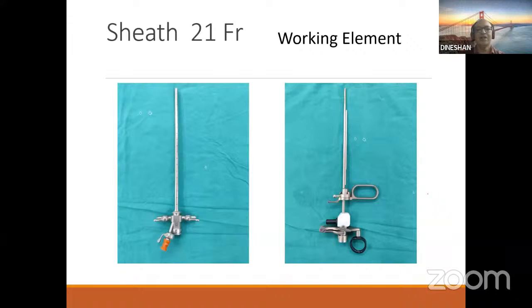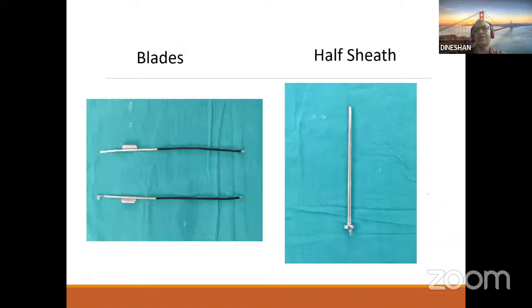But internal urethrotomy as such is indicated only in short segment strictures where there is minimal spongiofibrosis. In those situations, this problem will not occur. You will be able to pass the catheter straight away. But if you are in a difficult stricture, in selected cases, it is not a standard indication. Difficult strictures, if you are forced to cut them, then these instruments, this outer half sheath, may be useful.